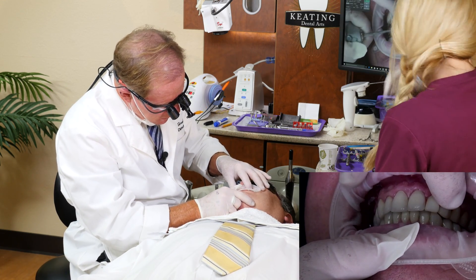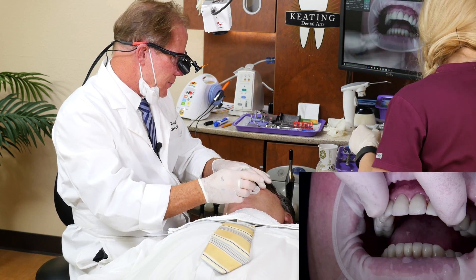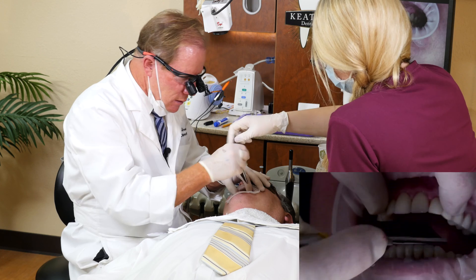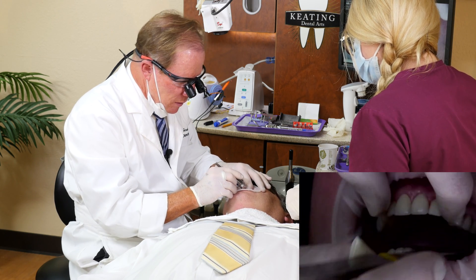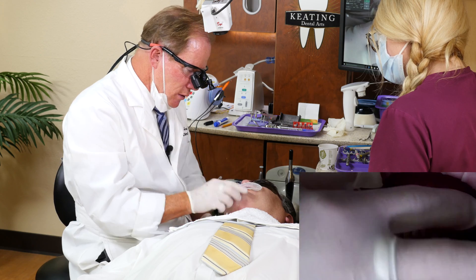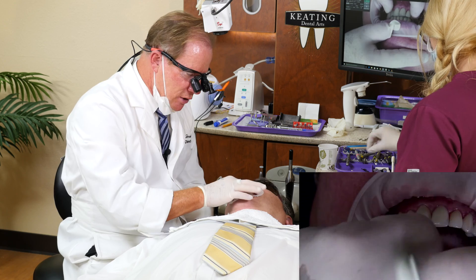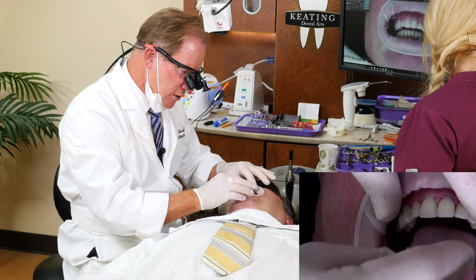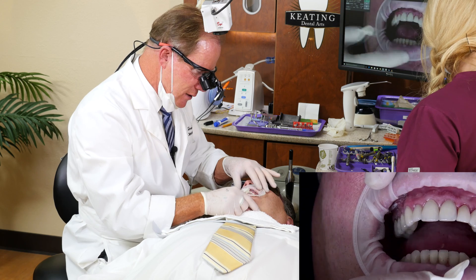Bite down gently — how's that feel? Check the contact occlusal. Tap up and down, slide to your left. The fact that we took basically a three-quarter arch digital impression means the lab was able to match the contours of the adjacent tooth, mount it, and go through the lateral excursive movements. We want canine guidance — and we have it.